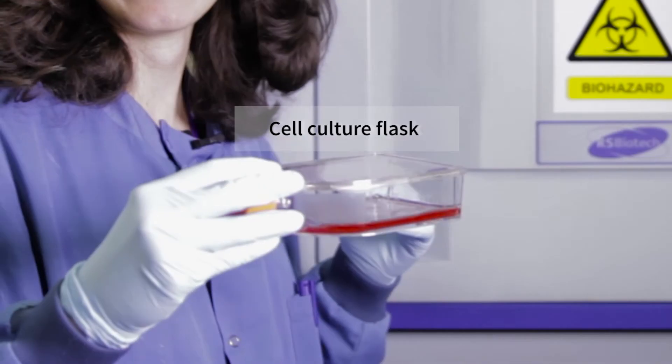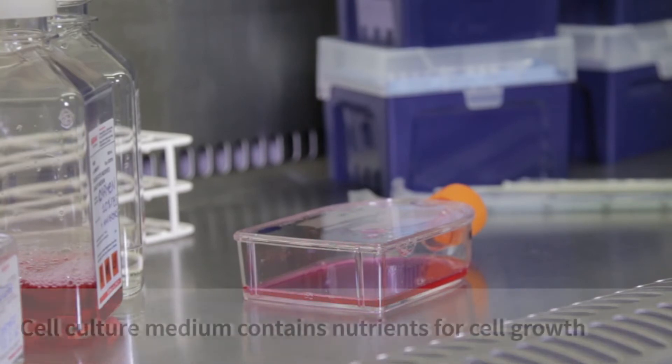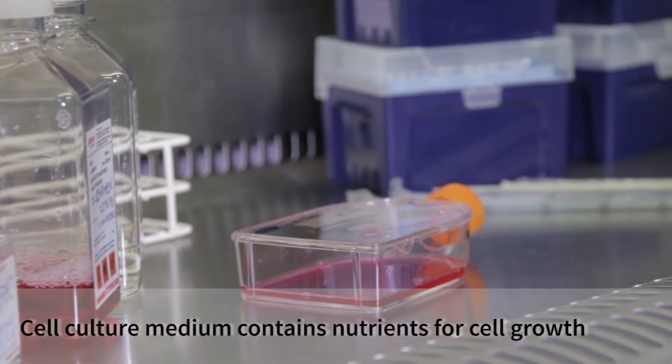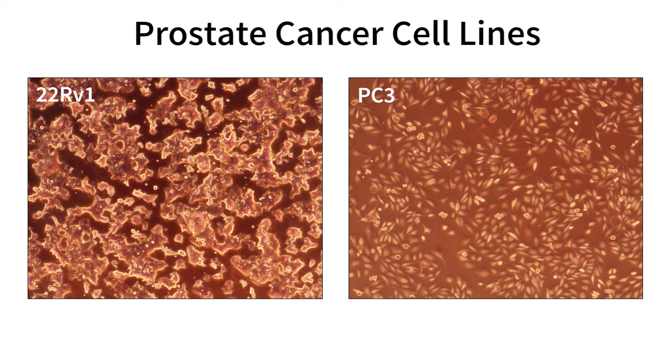Adherent cell lines can be cultured in different kinds of flasks, like this one. The cells grow attached to the bottom surface of the flask. This pink liquid is the culture medium. It contains all the nutrients that the cell needs to grow. I will now show you two different cell lines. Both are prostate cancer cell lines.